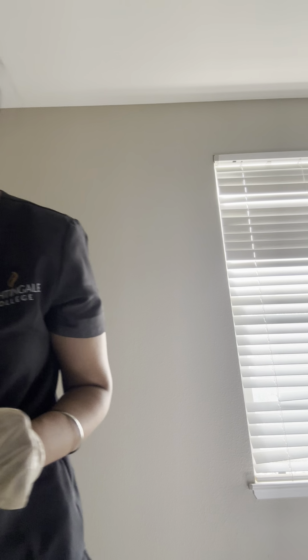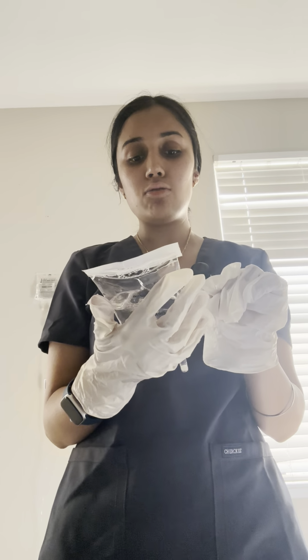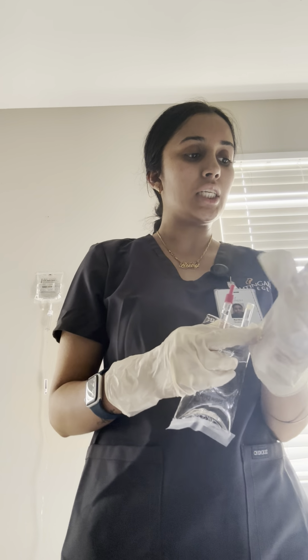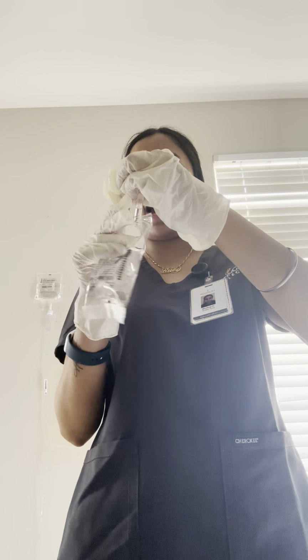And then the next step in our procedure is to grab the secondary fluid bag. So we have our secondary fluid bag right here. And then the same steps, you want to confirm that it is the right fluid, the right dosage. Look at the expiration date. So our secondary fluid is amoxicillin. So what you want to do is turn it over towards you, so the red cap is facing you, and then the same steps, we would twist off the red cap.